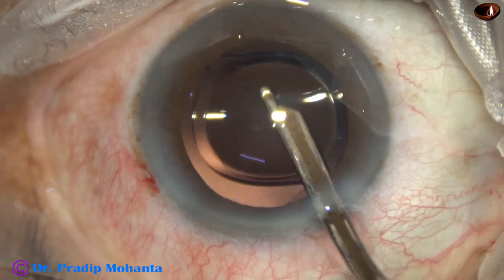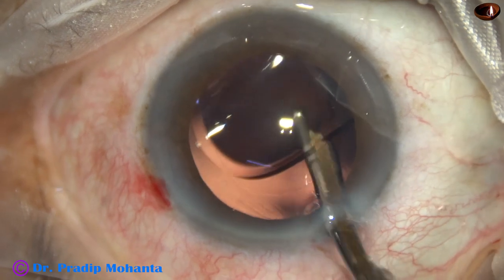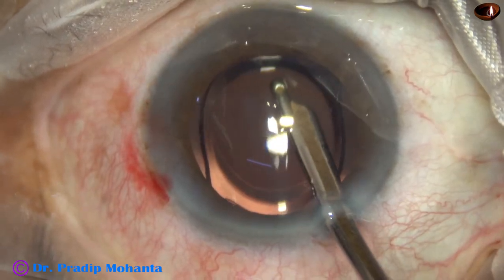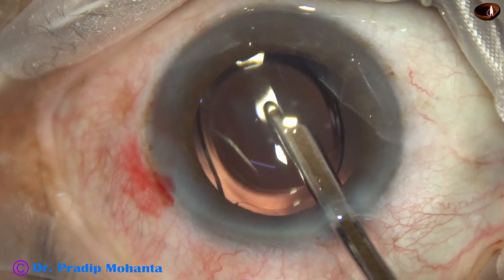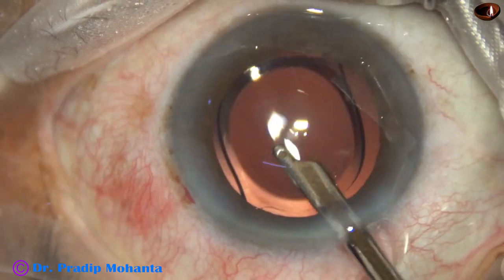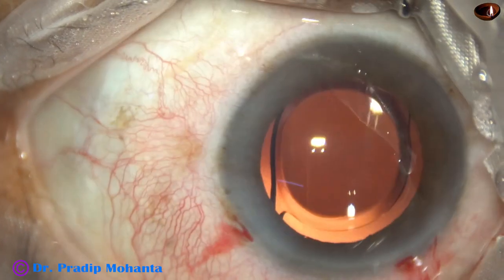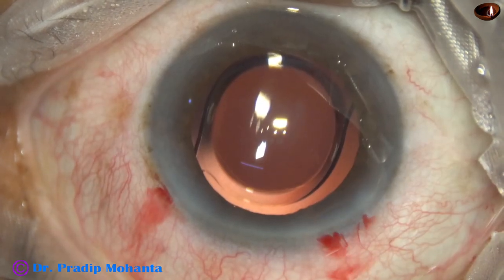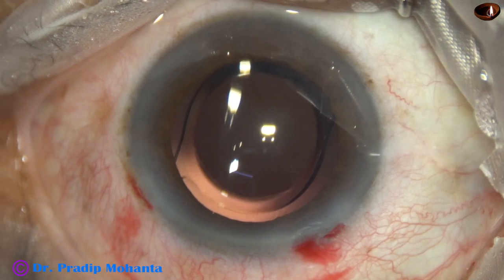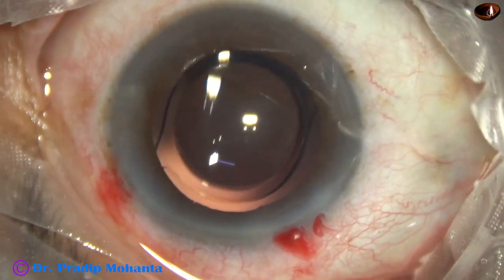The lens has not yet unfolded completely. Almost 30 seconds it has been inside the bag and it is still not totally unfolded — some concavity of the anterior surface is still there. The anterior chamber is nicely formed. Integrity of all the wounds is checked. A few drops of moxifloxacin are applied over the ocular surface, and the case is concluded.